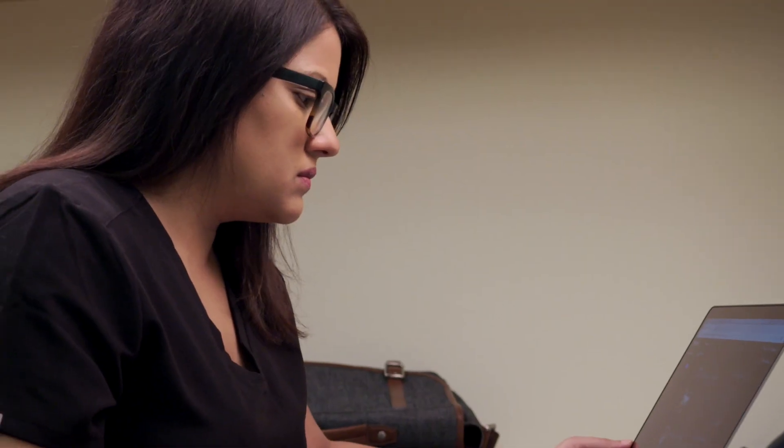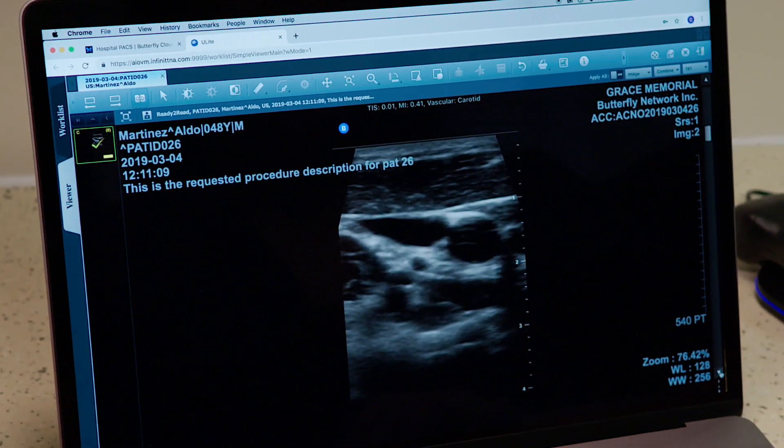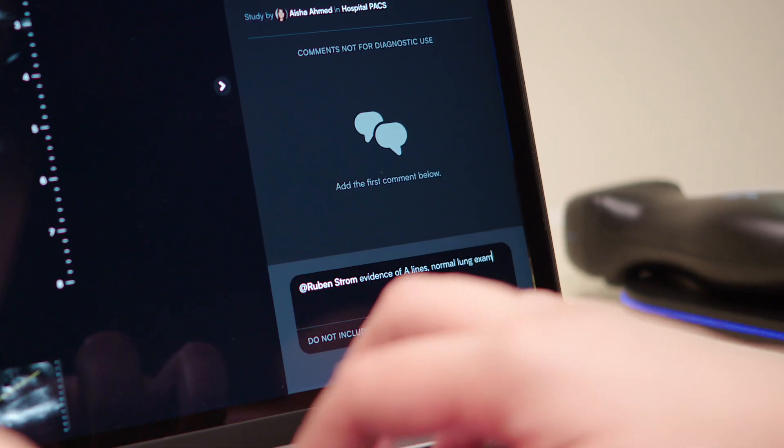Want to connect to your hospital? No problem. Configure your cloud so studies push automatically to your pacs. With the Butterfly Cloud, collaboration is seamless.